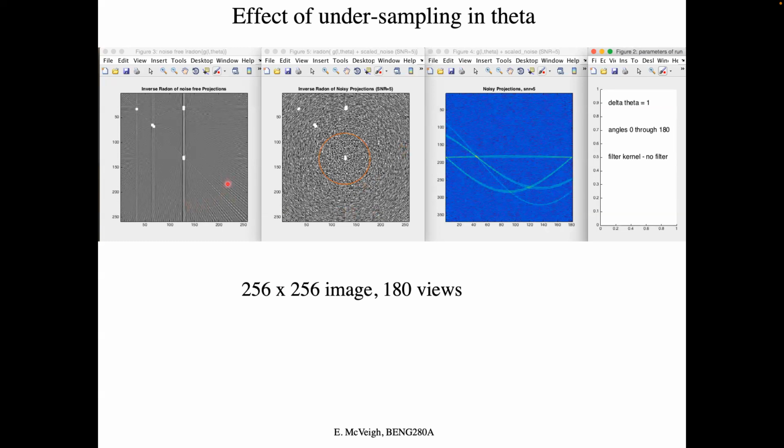We see that there's artifact at some points in this field of view. We see that the noise has a strange looking characteristic out here versus inside here. Inside, the noise looks just kind of like a random white noise field. There aren't correlations the way there are these correlations in theta out here, right? And that looks even better on your screen actually, because this one blurs it a bit. So you can see the difference.